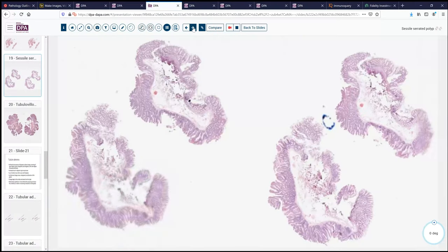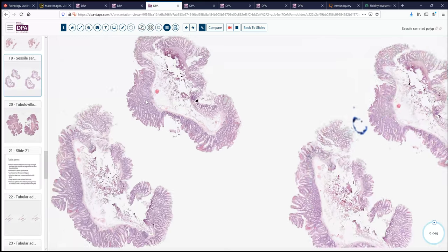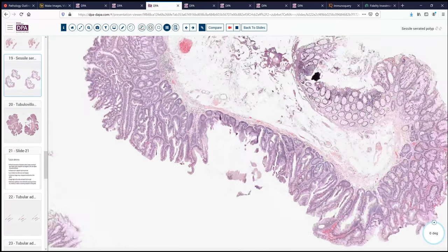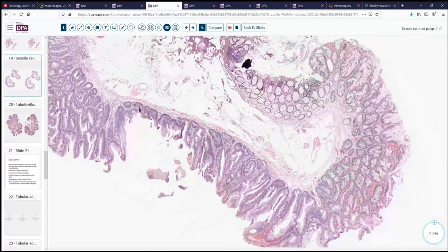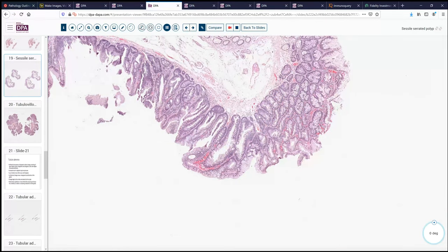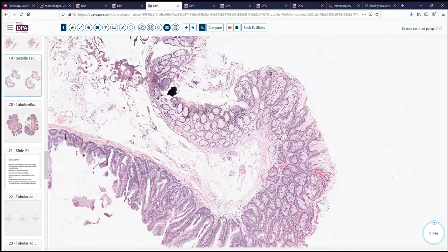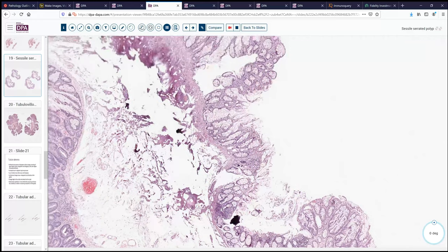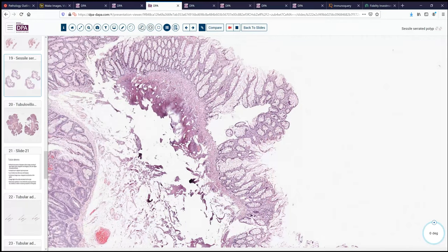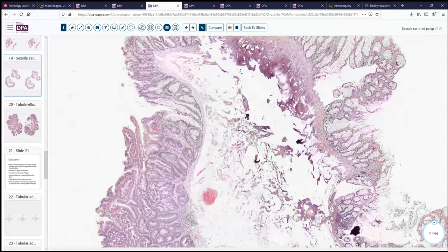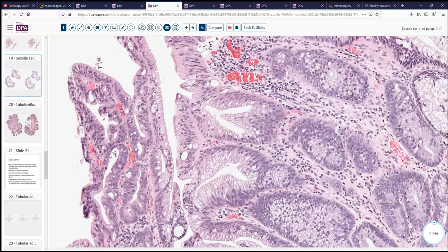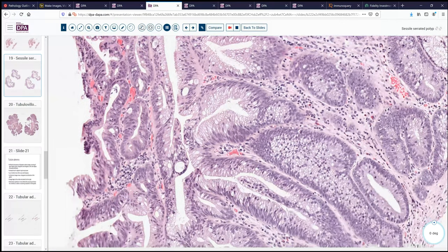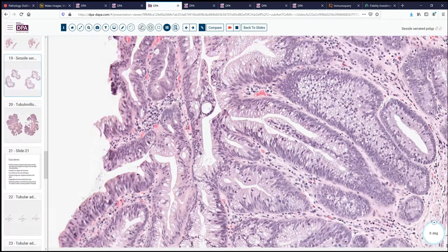Let's look at another example. Here's a fairly good-sized lesion, not as tall or complex as the previous one, but we see up here the beginnings of some villus-type architecture as these lesions become elongated. We want to first establish: is this a traditional serrated adenoma or a sessile serrated adenoma? There are some areas that are a little bit more complex and could be a usual sessile serrated adenoma, with a little bit of deep glandular dilatation. But here we are seeing these villus elongations, and these are the ectopic microcrypts that one sees in traditional serrated adenoma.